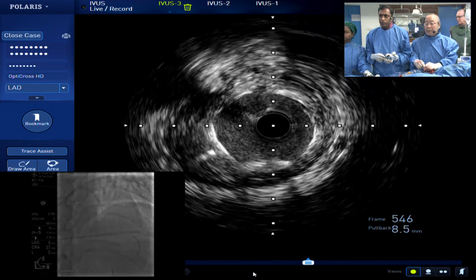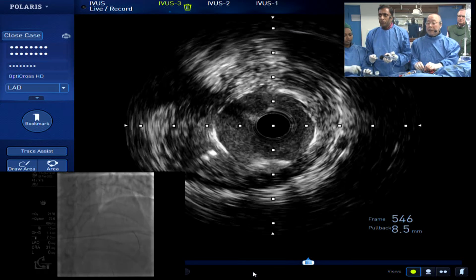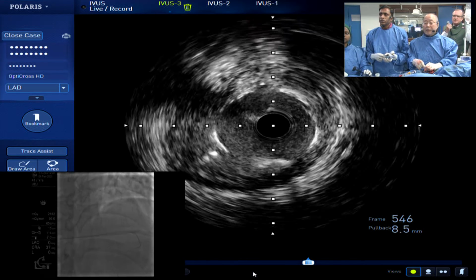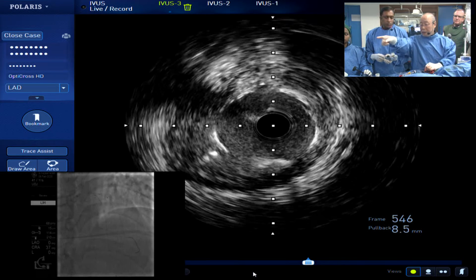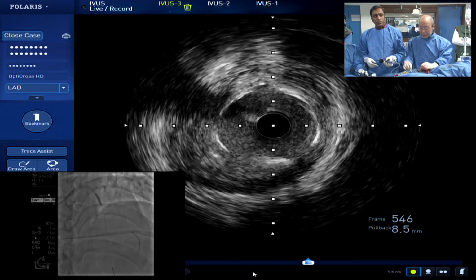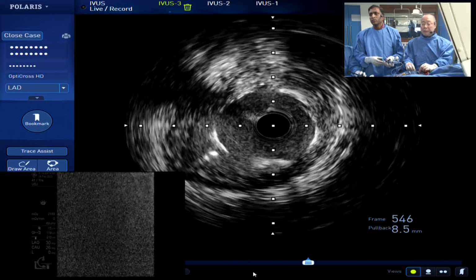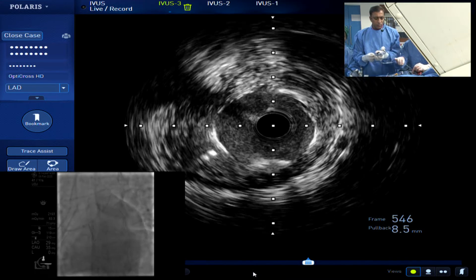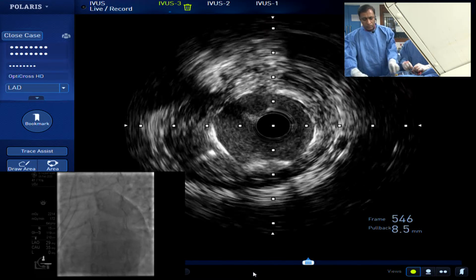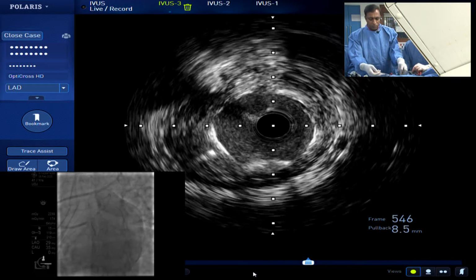16. Okay, deflate. Then come to the proximal. Okay, so another dilatation, 16. Yeah, and remembering it was only deployed at 10 atmospheres initially. Maybe come to the previous projection, this caudal, LAO caudal. This is the diagonal. Test, please. Maybe it's fine.